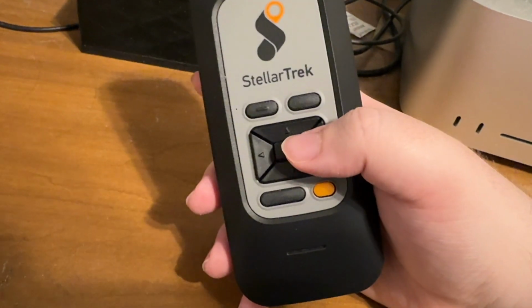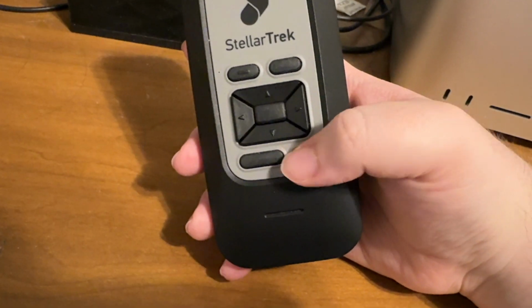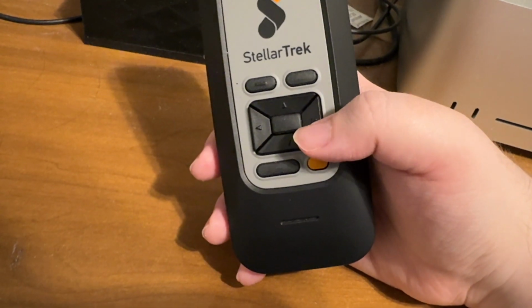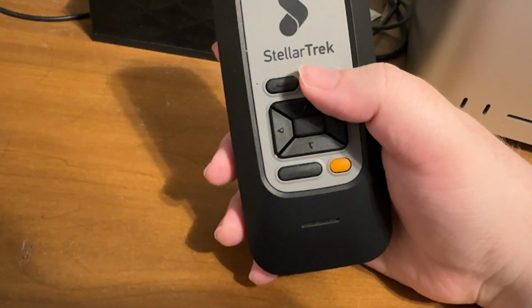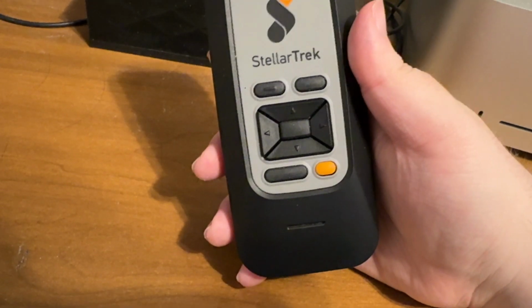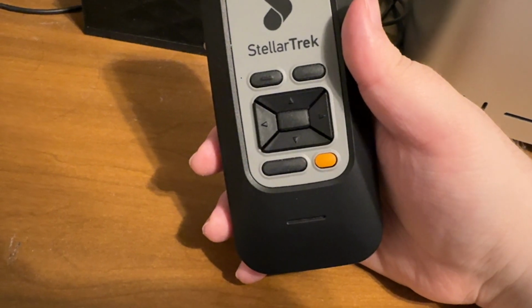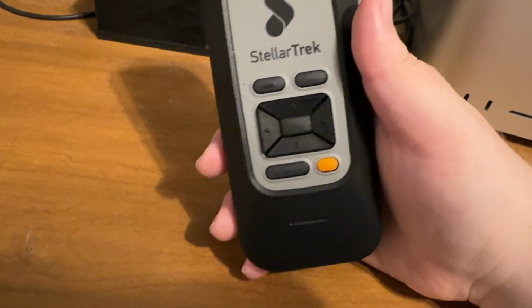So I typed in Dunkin', and we can verify that by pressing the voice key, which is the bottom right key on the keypad. Dunkin'. D. U. N. K. I. N. So it did confirm that's what we want. So let's press the go to key. Dunkin'. Your landmark has been renamed successfully. Select a landmark as your destination. 6 landmarks. Dunkin'. Quincy, Massachusetts.